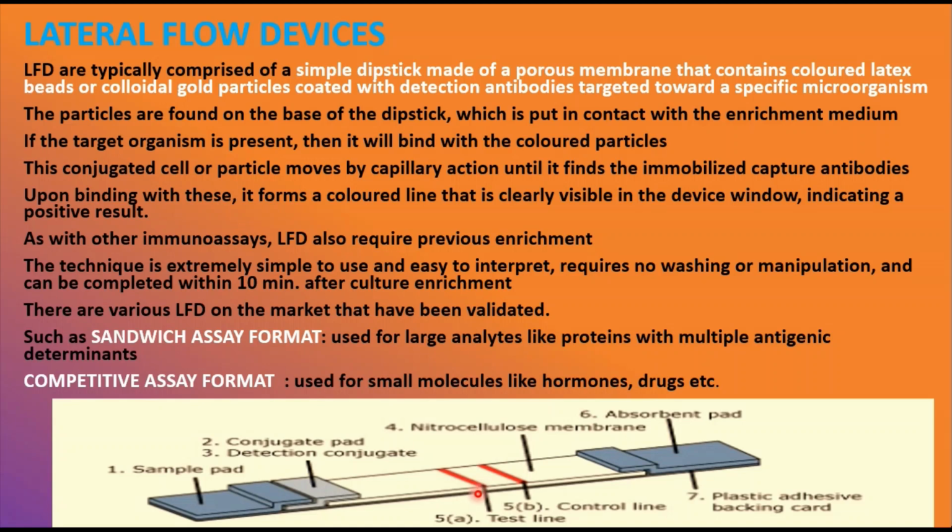So there are various types of LFD, that is lateral flow devices, that are available in the market, like the sandwich assay format, which is used for analyte proteins with multiple antigenic determinants. And in the same manner, we have another type of LFD, that is the competitive assay format, used for small molecules like hormones and drugs, etc.